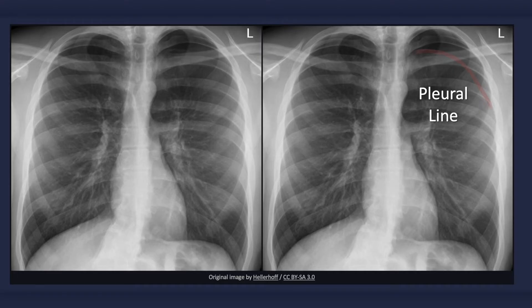Again, notice the lack of pulmonary vascular markings in the area beyond the pleural line. Now if the lung is consolidated, then the visceral pleura won't be distinguishable as a separate line, but rather as the edge of the consolidation.